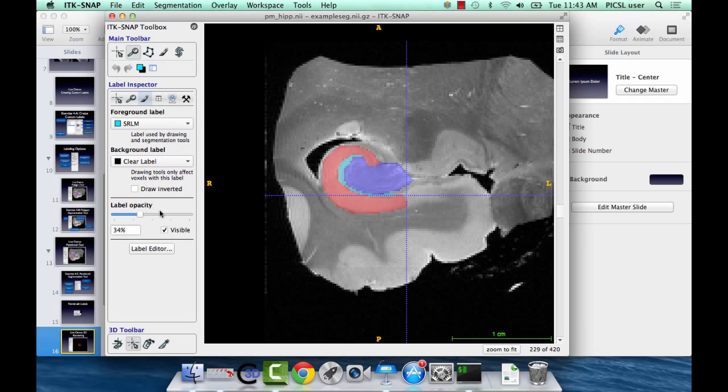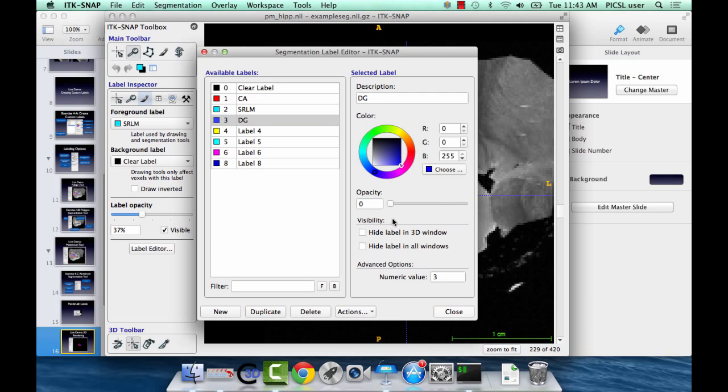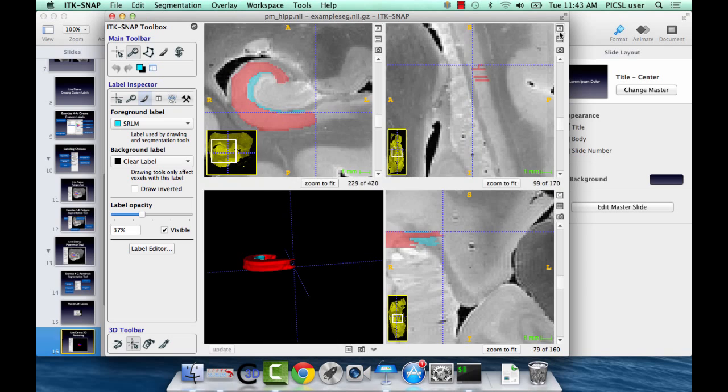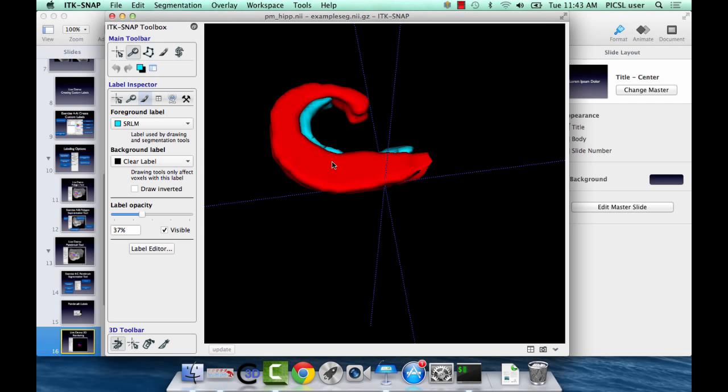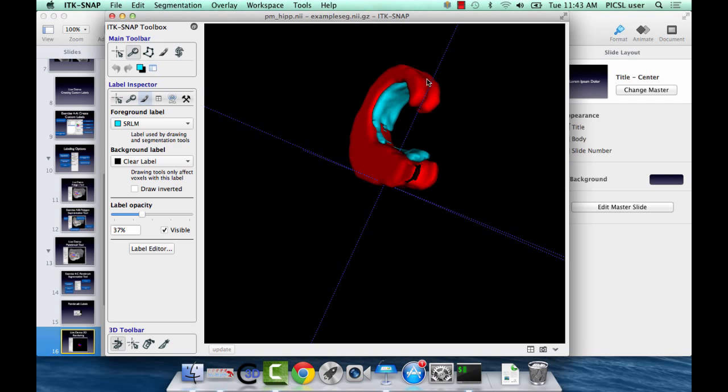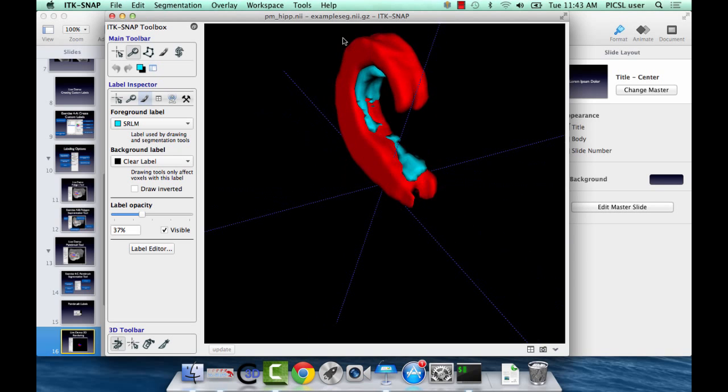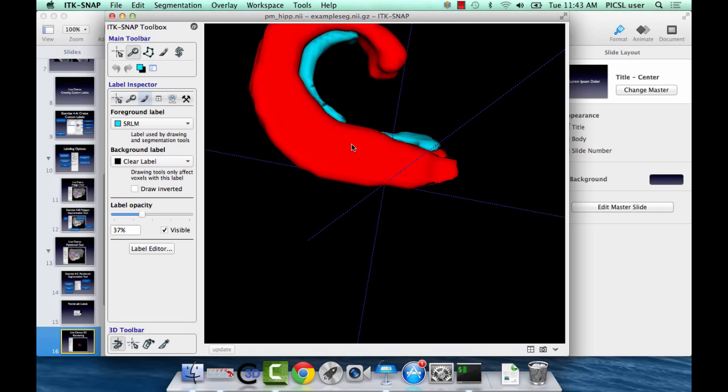And another example, if we were to go in the label editor, say we wanted to just look at how CA looks throughout the whole segmentation. We can turn this label off, and then in the 3D render, the dentate is also removed. So, we can take a look, check out how this entry point of CA into dentate looks, or make sure SRLM is consistent. With a difficult structure like the hippocampus, it's this twisted, deep medial temporal lobe structure. So, it can be pretty hard to just see what it's supposed to look like slice by slice. So, when you look at it in 3D, you can see if you get this really weird shape or something bulging out that can help you differentiate what's actually tissue from just noise or white matter or something you don't want to segment.